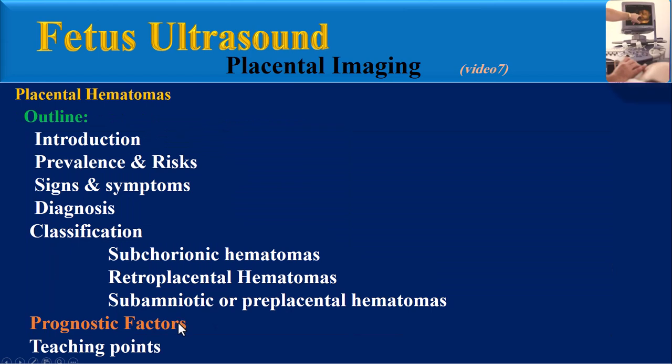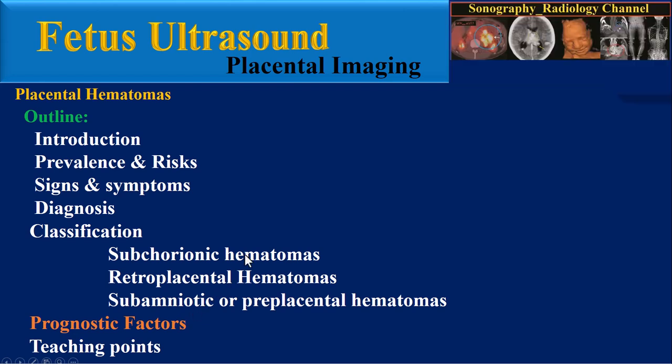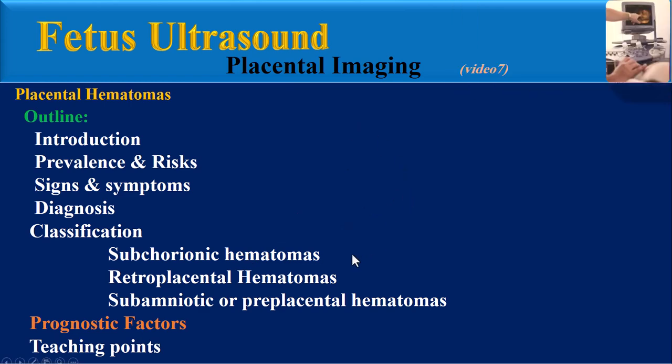Prognostic factors. Multiple factors, including the volume and location of intrauterine hematoma, diagnosed gestational age, duration, and simultaneous presence or absence of vaginal bleeding, may play important roles in the prognosis for pregnancy outcomes.